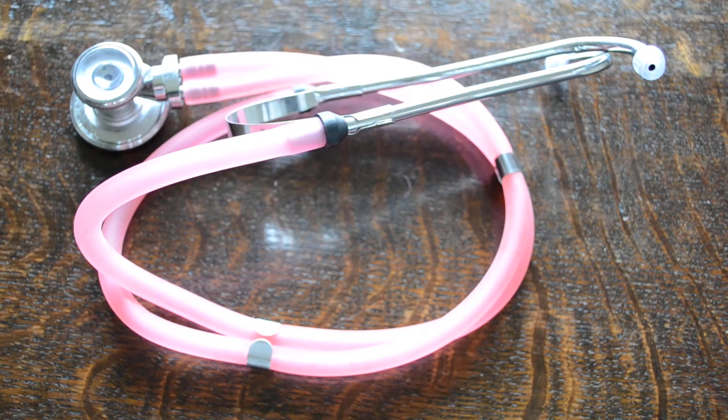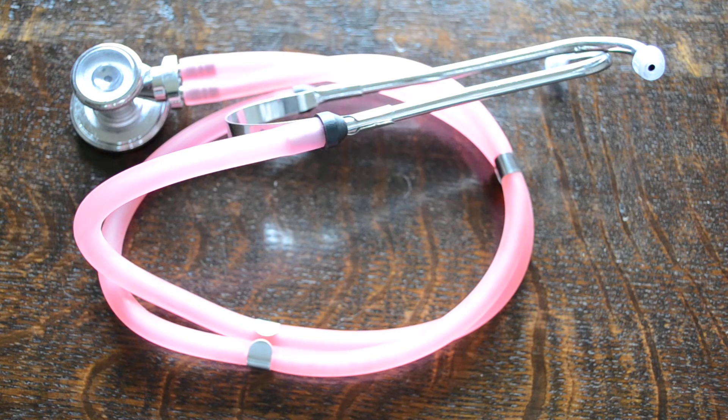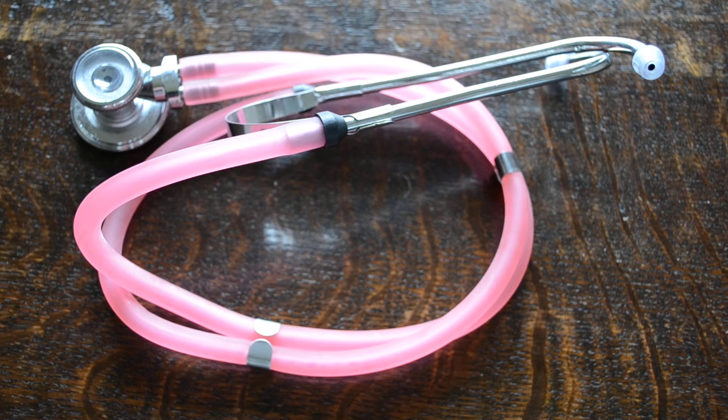Available from the ValueMed website. This unit costs just under 10 pounds to buy. With postage delivery, you're getting this great stethoscope for between 12 and 13 pounds depending on which postal route you select.